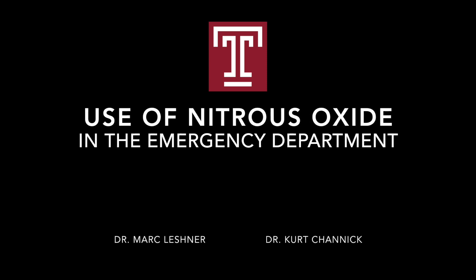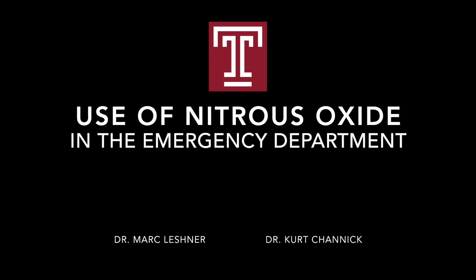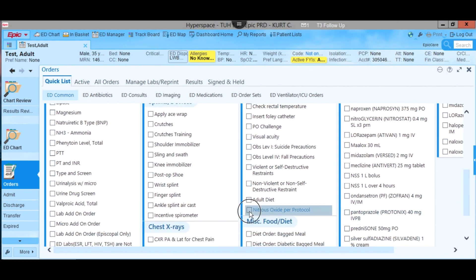This video is a demo on how to use nitrous oxide in the Temple Emergency Department. After obtaining consent from the patient, the first step is to place the order in EPIC to obtain the key from the Pyxis.